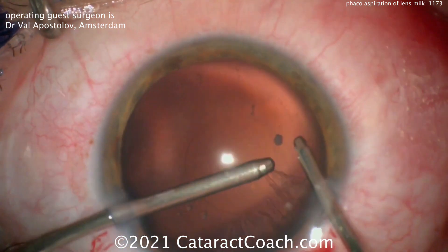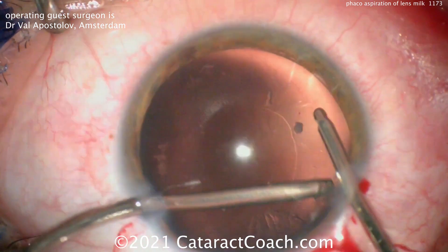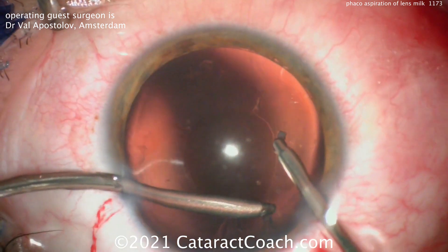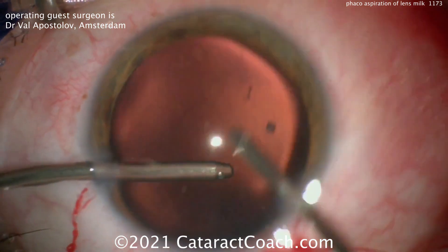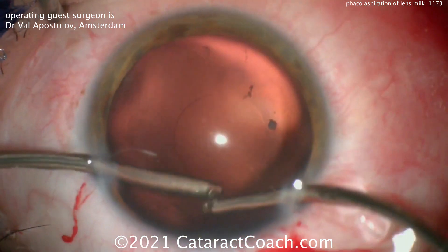Now the hands were switched — the aspirator is in the left hand and the irrigator is in the right hand — and full 360-degree access even through that small capsulorhexis is possible. I wouldn't leave a small capsulorhexis; I think we can enlarge it to a more reasonable size. Here's the very last bit of cortex — it came out very nicely.